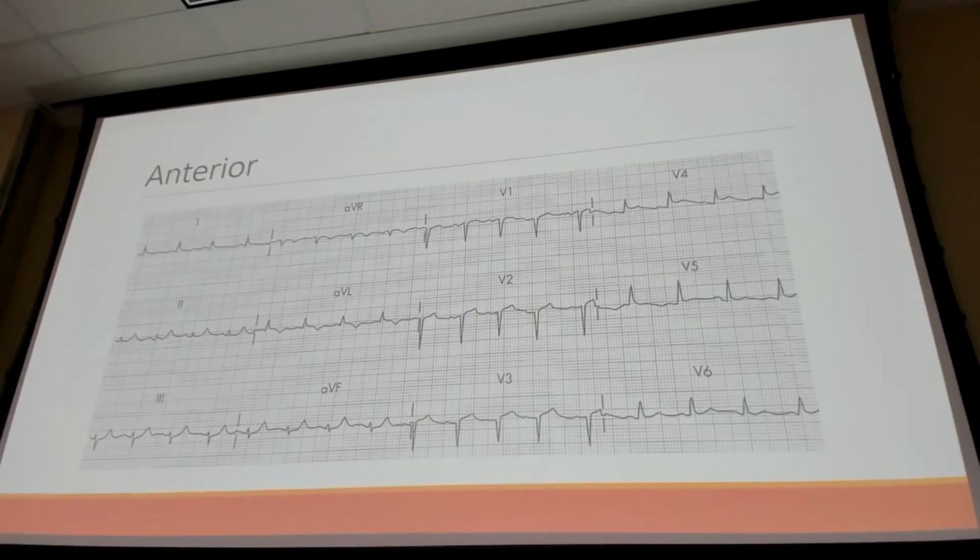So an easy way, if you have your EKG, is you just fold it to give you a straight line across, because you want to figure out where your baseline is. It's hard to tell whether the PR is depressed versus whether there's elevation on there. So that's an easy way to get a baseline across the tracing, and it makes it a little more obvious for these subtle ones.